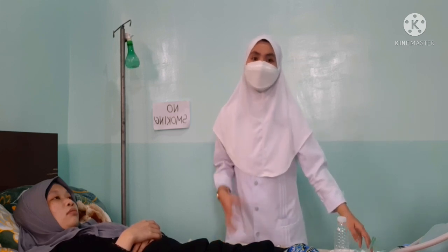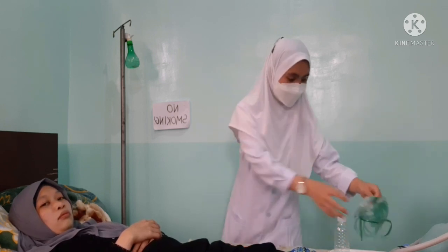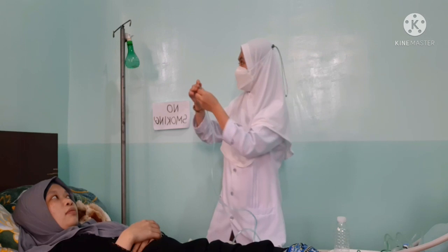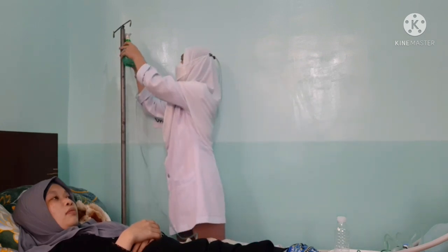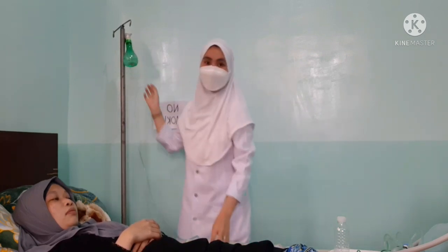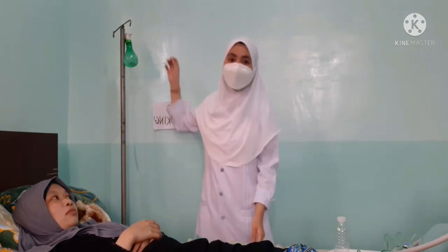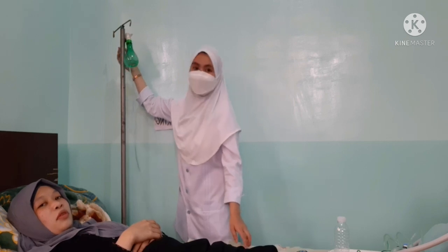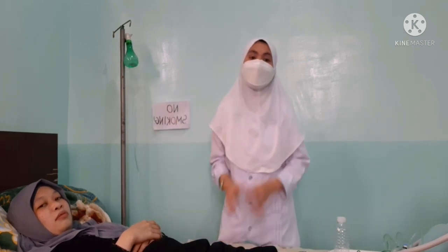Now, attach the connecting tube to the humidifier outlet. Attach the prescribed oxygen tubing and delivery device to the humidifier. And set the flow rate according to the doctor's order. Turn on the oxygen at the prescribed rate and ensure proper functioning.